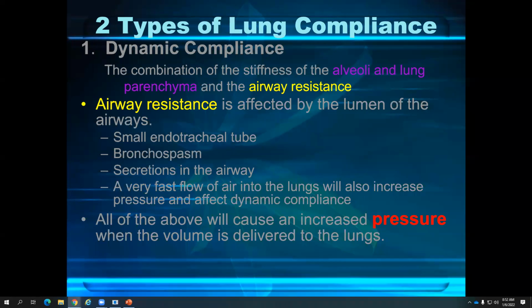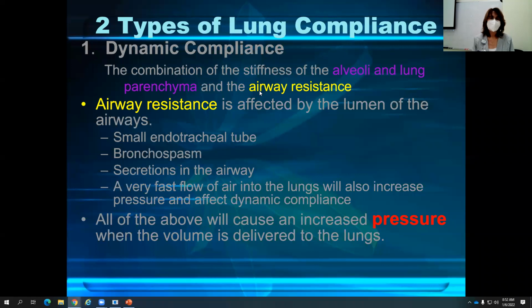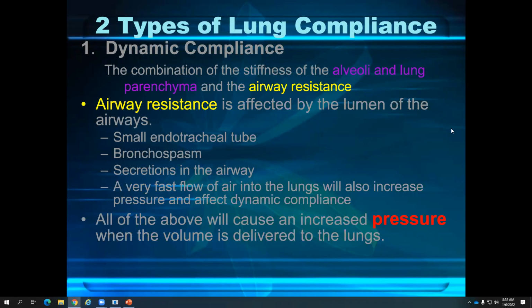As far as resistance, can you explain to me what your understanding of resistance is? I think airway resistance is about when you're trying to push air inside of the airway, you've got to apply more pressure, or there should be stronger pressure to put it in, because there's some kind of... I don't know how to really explain it.